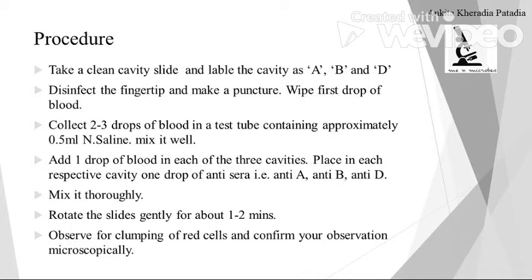Before collecting, please wipe the first drop of blood, and then by slightly squeezing, develop the second blood drop for the collection. Now collect 2 to 3 blood drops in the test tube, or you can directly collect on the cavity slide also.